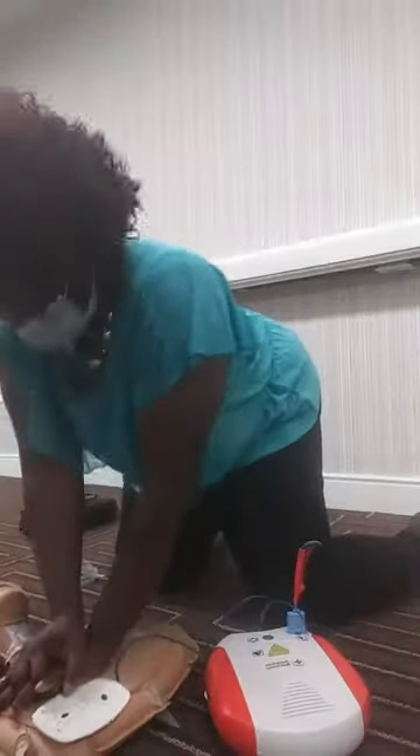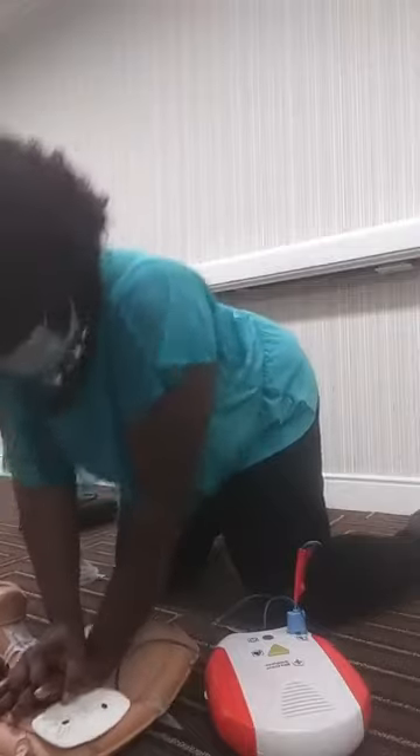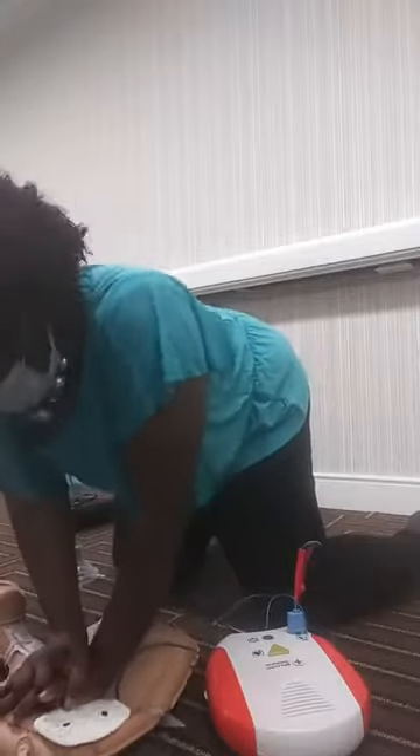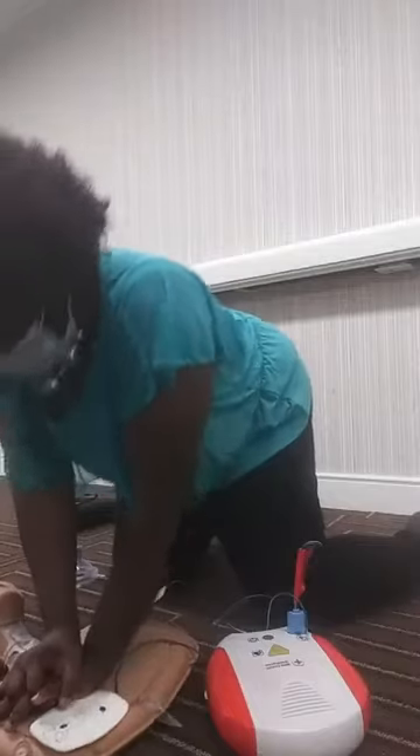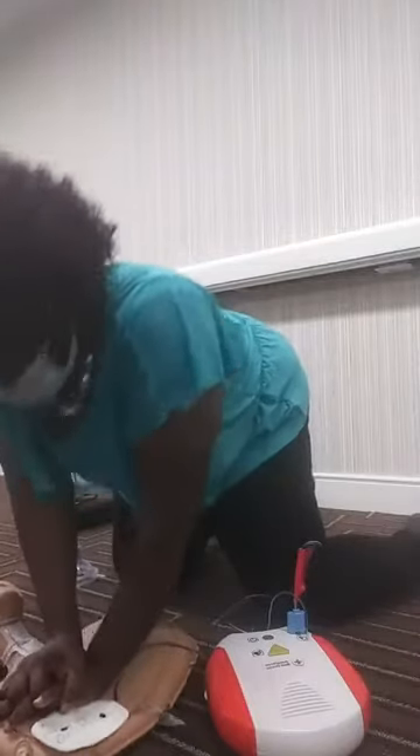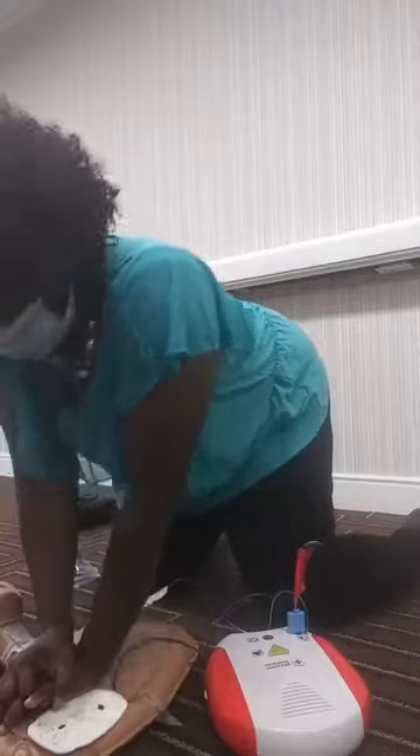Perform chest compressions, counting out loud: one, two, three, four, five, six, seven, eight, nine, ten, eleven, twelve, thirteen, fourteen, fifteen, sixteen, seventeen, eighteen, nineteen, twenty — continuing up to thirty compressions per cycle.